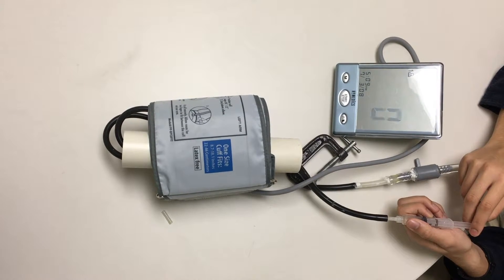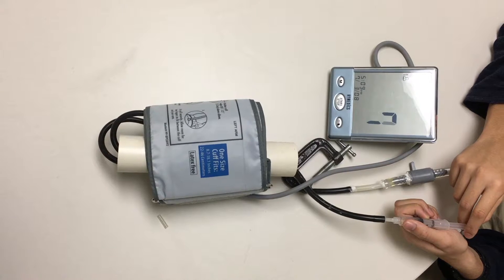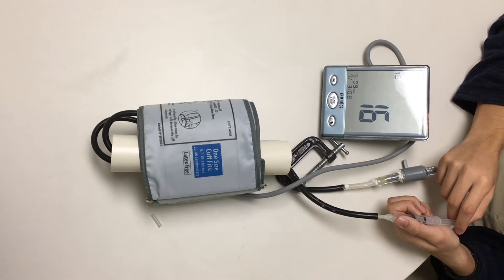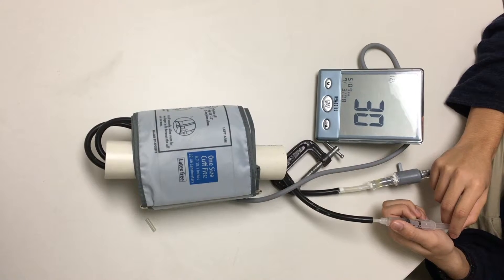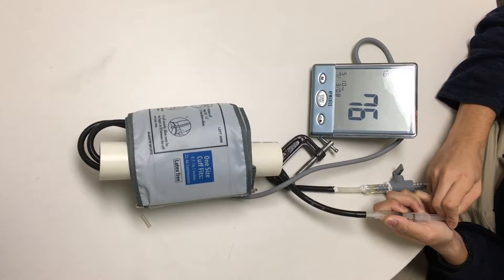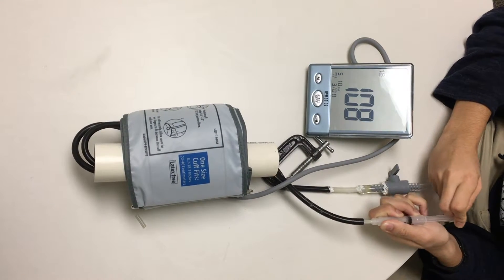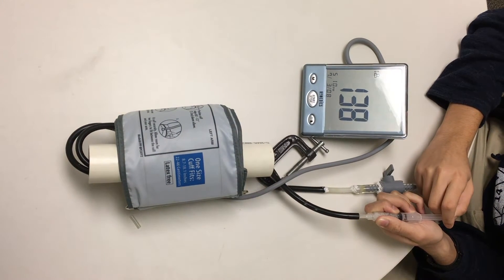Hello, I will be presenting the working prototype. We wait till 50 millimeters of mercury to begin pumping. At 50 we do small pumps, and at 70 we speed up the pumping.